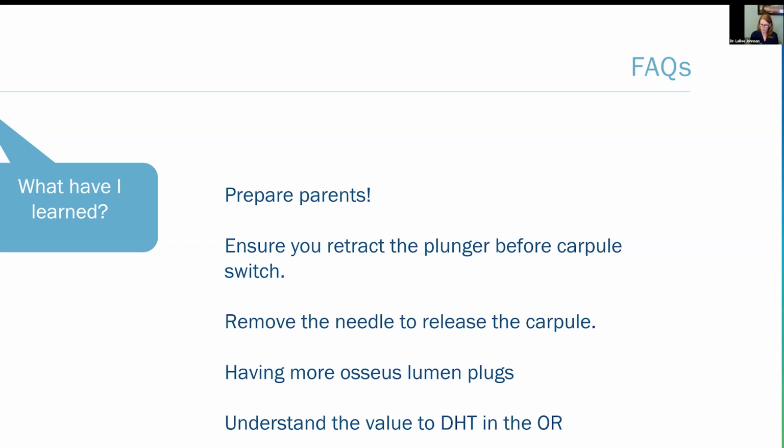They're like, push the pedal, because they have to wait for it to come back. And so they're going to get impatient and try to unscrew it. So as soon as you're done with the cartridge, teach yourself just to touch that, retract that pedal, so they're not tempted to be impatient and potentially put pressure on your plunger, which is very bad. And it's probably the most sensitive part of the device, if I had to guess.